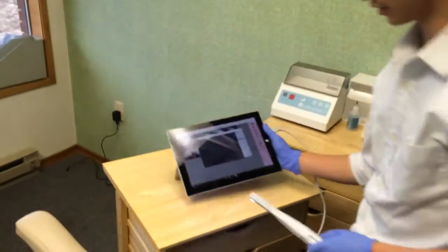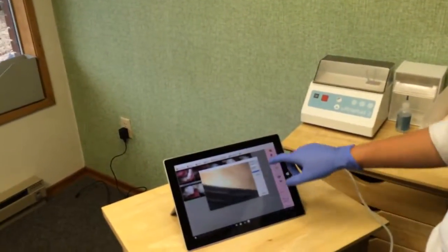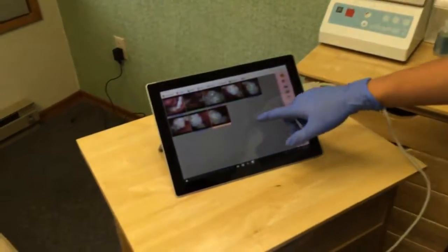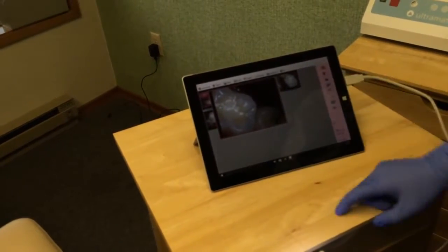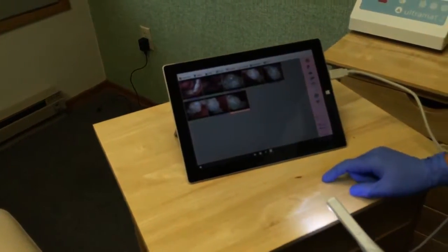Notice that all the images are stored locally on this machine. So I can just hit X right here to get rid of them. They're all there. Look at them just like that. There we have them. Double tap them again to put them away. Just like that. There we go. And so that's where they are.